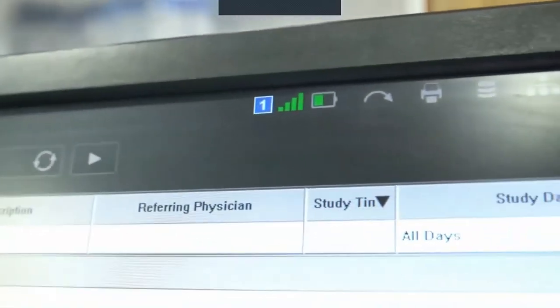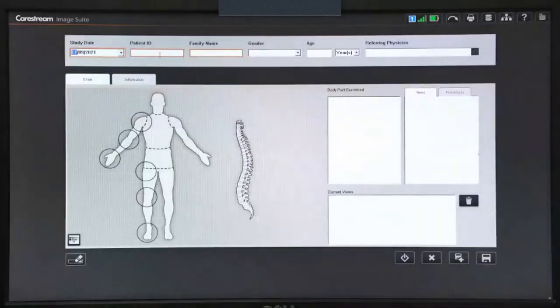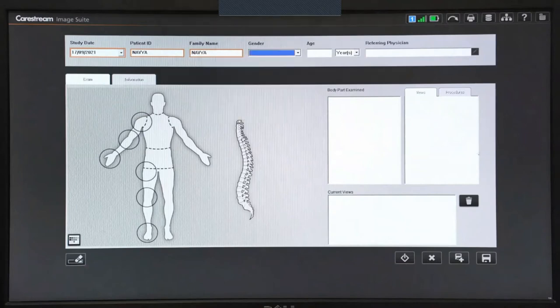And then you can see the Wi-Fi mode on the detector. He enters the patient details at the console, name and then ID, everything. Usually when we are connected to HIMS, this comes into the system automatically, where you just need to select a particular code, our ID number, and that will automatically fill in all the name details of the patient.